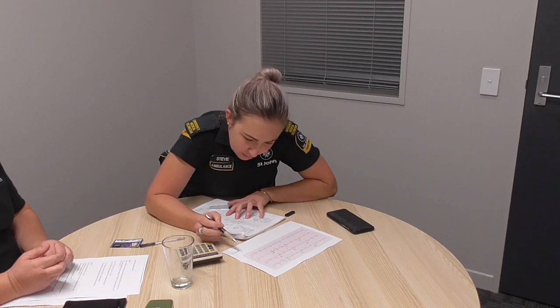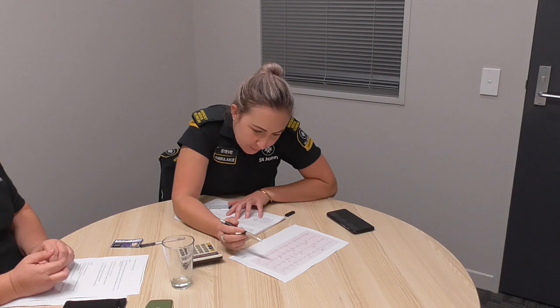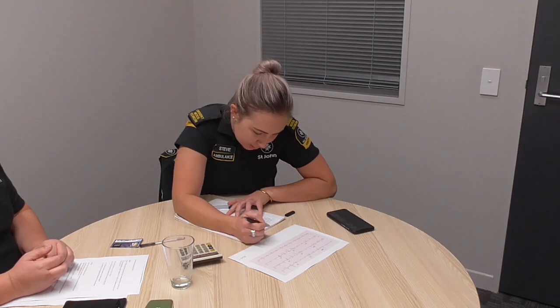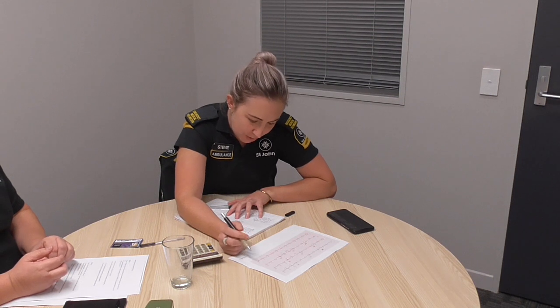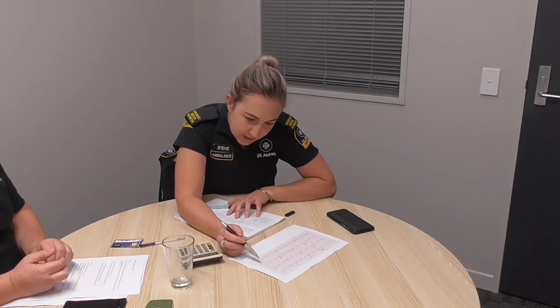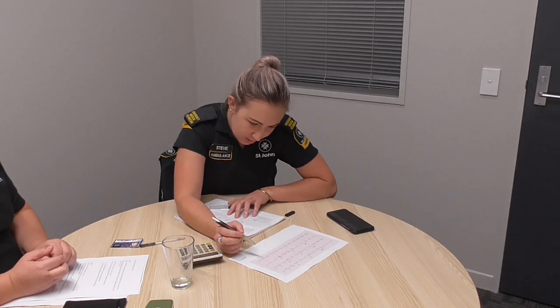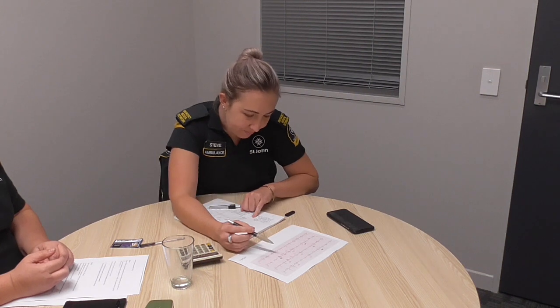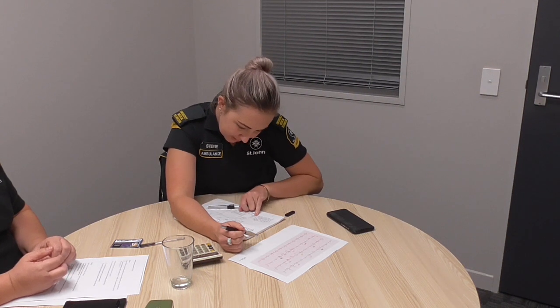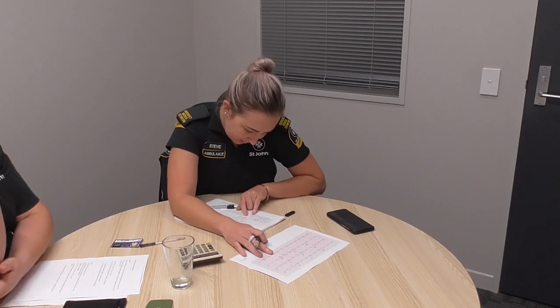Paper speed is not written on here, but it should be 25 millimeters per second. And the frequency also not here, but should be 0.05 to 150 hertz. Calibration spike is there, and it is 0.2 seconds. There's no time or date on here, but we've been given 4:30 in the morning. Patient information is 62-year-old male. This is a nice tidy reading.